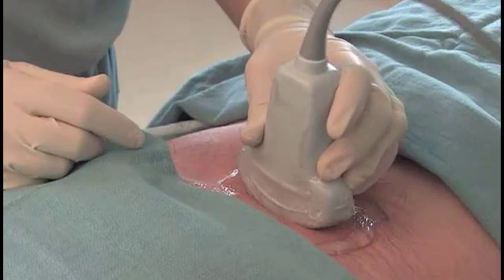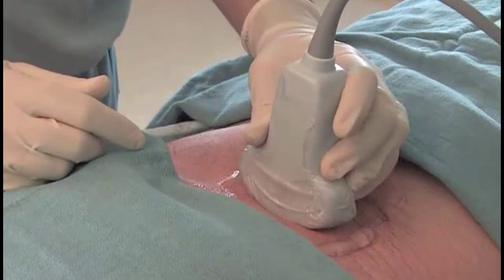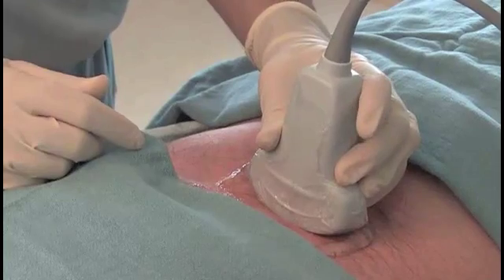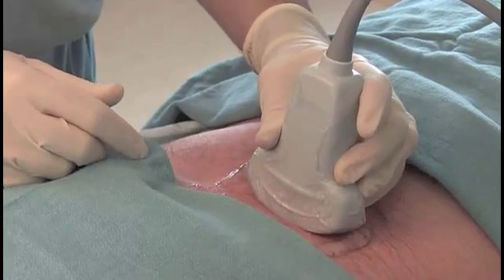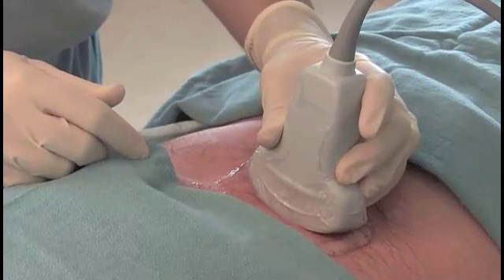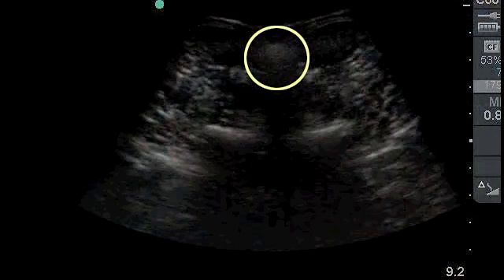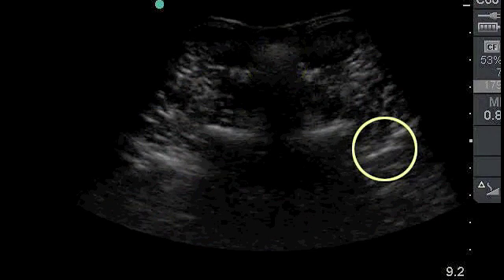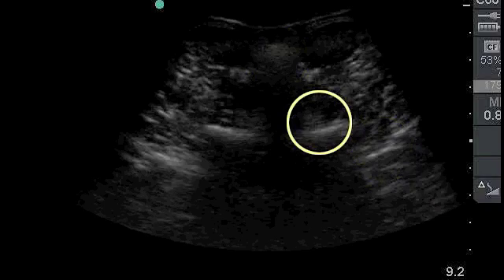After the target segment is identified, a transverse view is obtained and considered adequate when the three-step or saw sign structure is seen. This view is comprised of the highly echogenic spinous process superficially, the transverse process more deeply, and the zygapophyseal joint between these two bony landmarks.